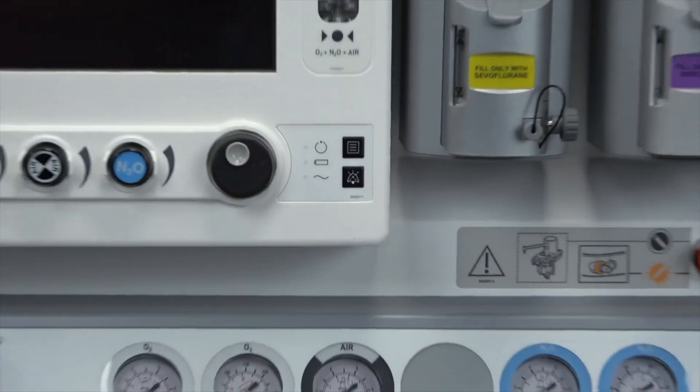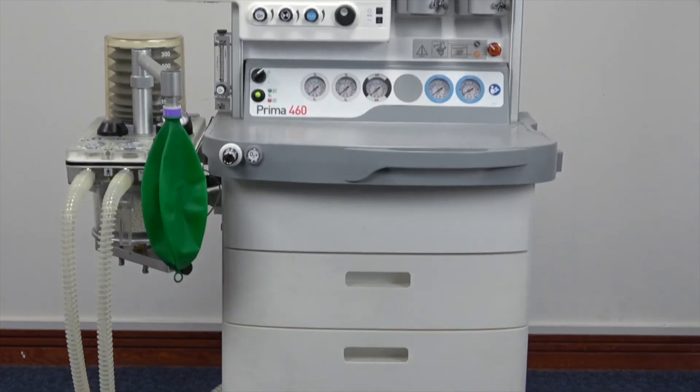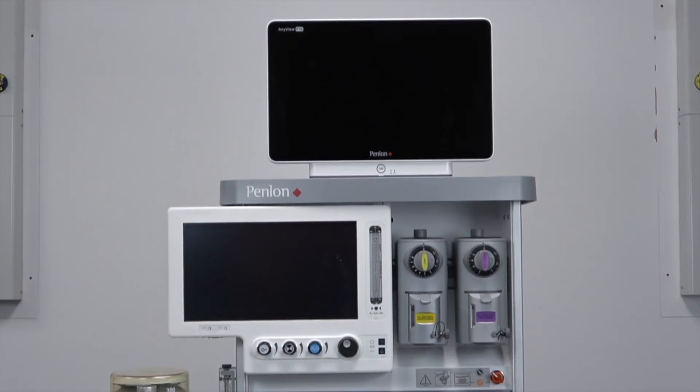The Penlon Prima 460 anaesthetic machine is manufactured in the UK and designed for use across the globe. Visit Penlon.com to learn more.